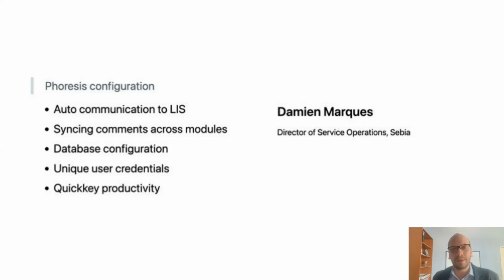For example, he helped us set up an automatic communication to the LIS, so there's no manual clicking of transmit. He helped us make sure that our interpretive comments stay synced across modules.